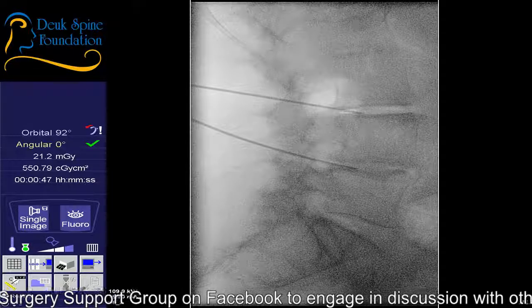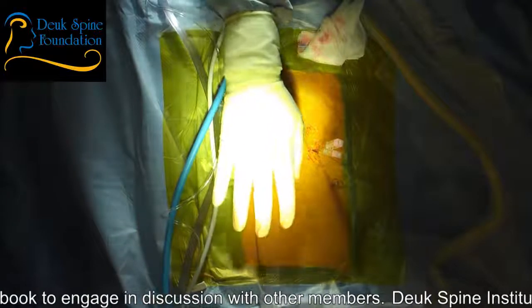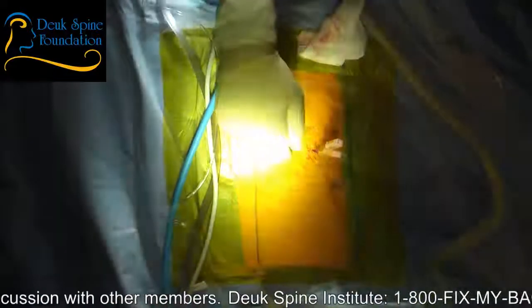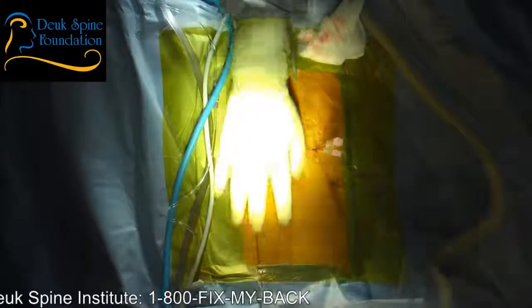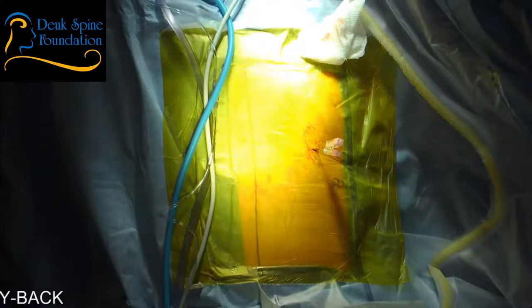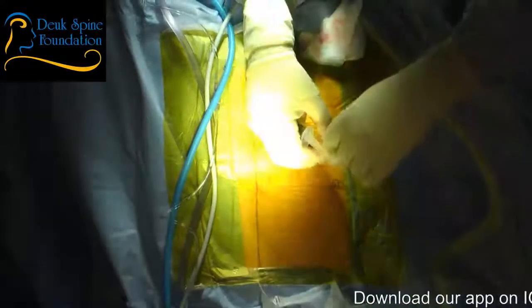So sometimes the patient loosens up a little bit, like their back relaxes. Remember, the muscles back here in the patient's back, what is one of the bigger causes of back pain? Muscle spasms. Why do muscle spasms? They spasm because of what we call instability. So there's something in the spine, a disc problem, a facet problem, it causes pain. That pain suddenly causes everything to tighten up, and they get a spasm. So what's important during this procedure is that the patient is comfortable, not feeling pain, and then the muscles relax. And when they relax, I can do my surgery easier because there's not this compression of the bones together squeezing the disc space down, locking the disc space down. I won't be able to get my needle in there. Are you comfortable?